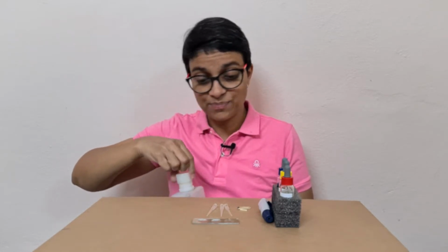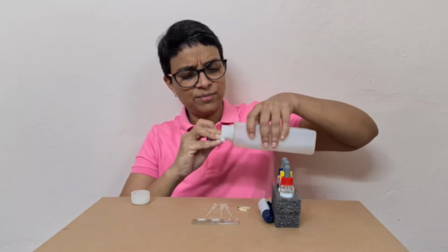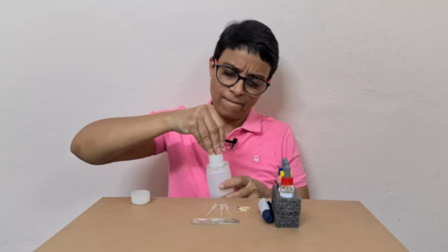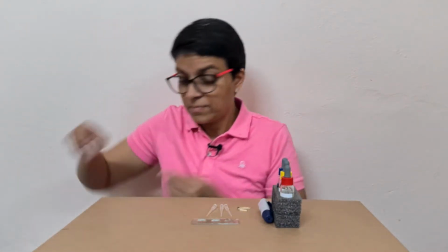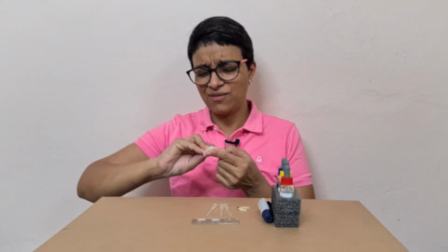Now we perform the experiment, and after that I take a little bit of ethanol, don't dip too much, and the excess you can pour back in the tube. I'll tell you in a minute what this A and B is.